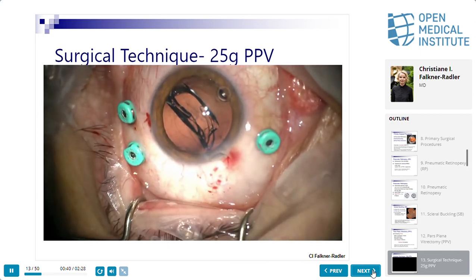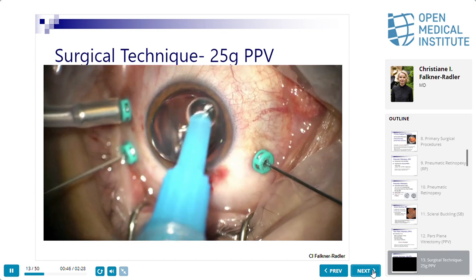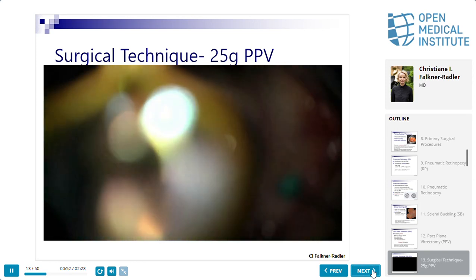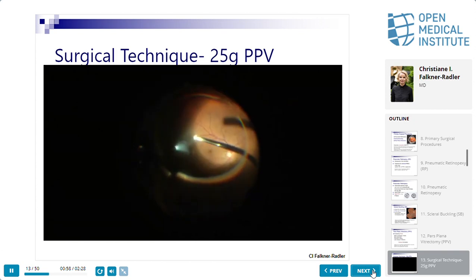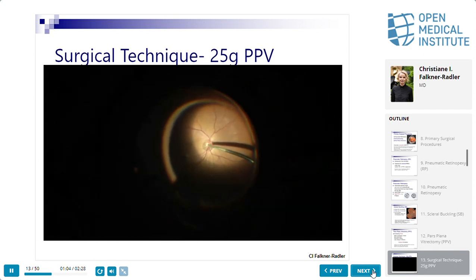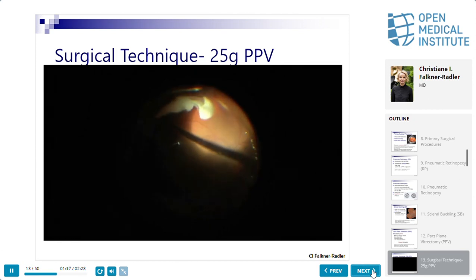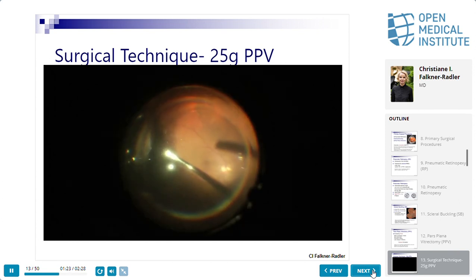We put in a standard lens. And in the detachment cases, because I do a lot of indentation, I prefer to put a suture on the cornea, which I remove afterwards. Here you see it. And now we do the anterior vitrectomy. We go inside, we do the core vitrectomy. You see that the detachment was already there, so we didn't have to induce it. Now I use heavy liquid, a PFCL bubble, and afterwards I like to use in my detachment cases triamcinolone, because I see the vitreous much better and I can clean the periphery much better.